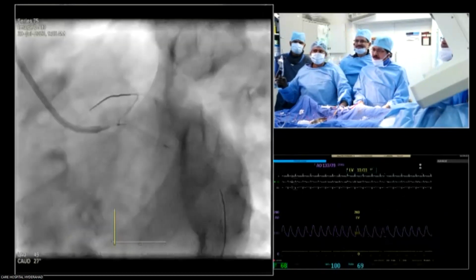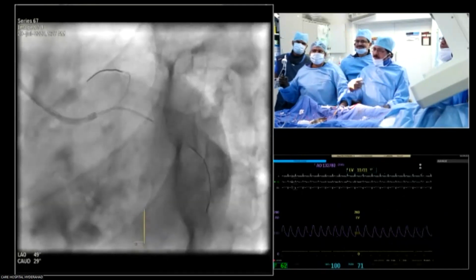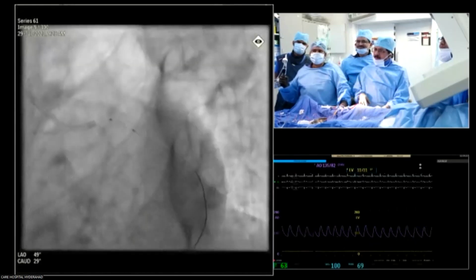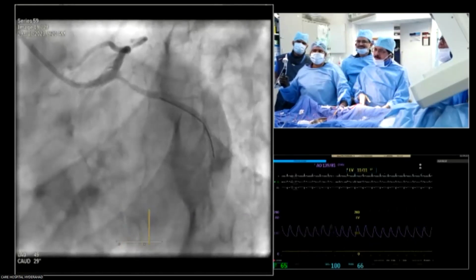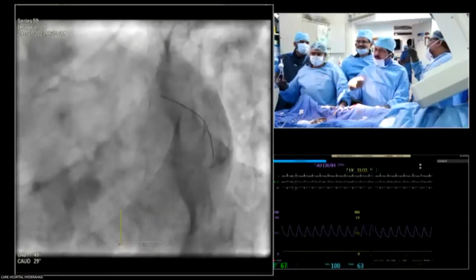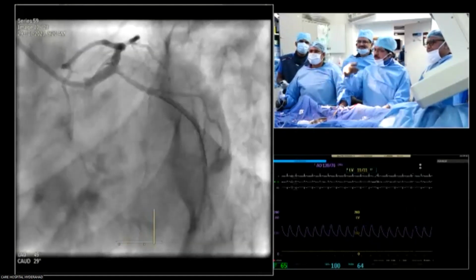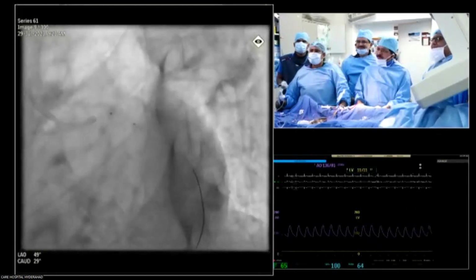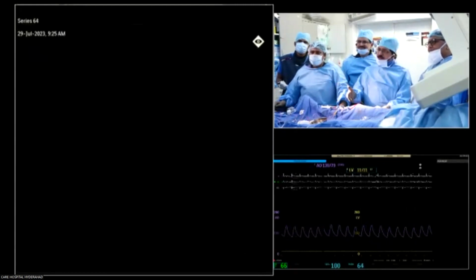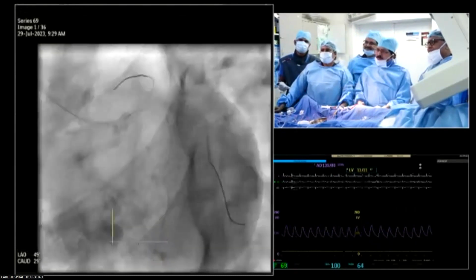So I guess this comes down to strategy, right? How much myocardium are you going to encumber by your approach? Here, I think the plan was to do the RCA antegrade and to do the circumflex as a standard angioplasty. Dr. Tiwari, is there an effect of whether or not you would choose the circumflex first if you planned on doing a primary retrograde RCA? I think seeing the morphology and the complexity of the RCA, it was justified to do the RCA first.